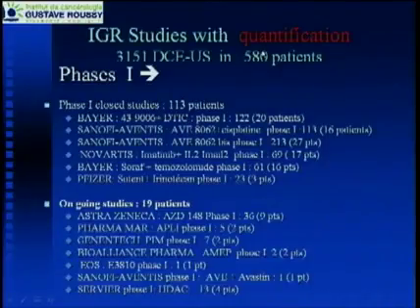So now let's move to the scientific results. On this slide, you understand that we had this technology in phase 1. Remember, phase 1 is a new study when you start the first use of the drugs in the patients. Remember, currently the international rule is only to use the RECIST criteria.